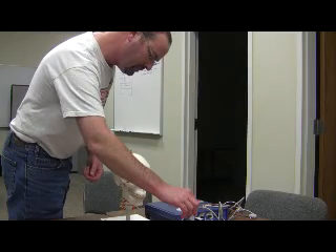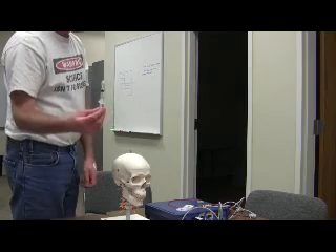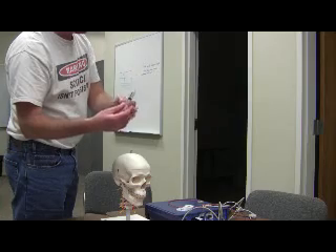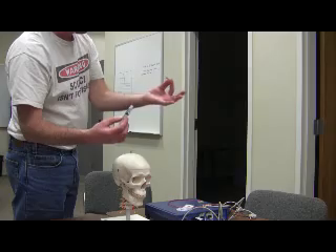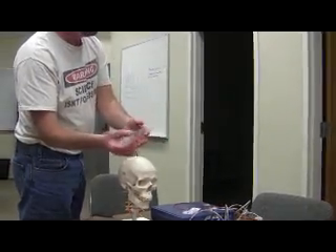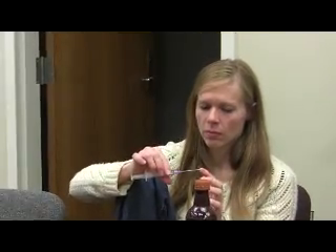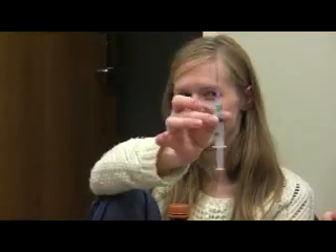We use what's called a luer lock syringe — you could use this to inject stuff in your bloodstream if you really wanted to, but the idea is that the needle comes separate. We have needles called dispensing needles, or blunt tip needles, because if you look at them and tap that, you'll notice it isn't going to penetrate anything. I have the long dispensing needles here; there are short ones as well, and those are going to come in very handy in this prep.